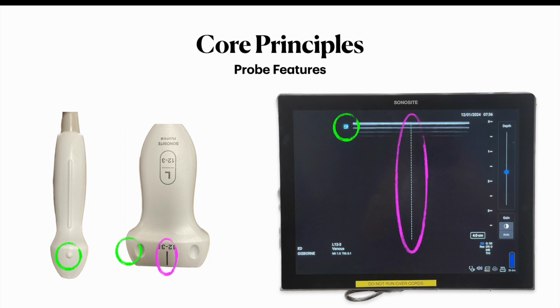The next feature to pay attention to is the center line. You can see that on the center of our linear probe, there's a straight line, which indicates the middle of the probe. And what I'll show you later in the lecture is how to activate the center line, which will appear as a dotted line on the screen and corresponds to the center line on the probe.